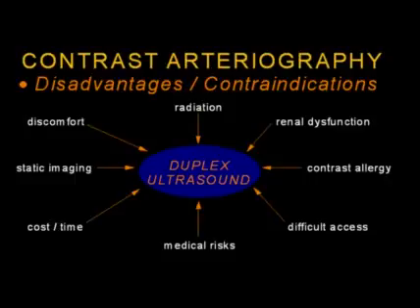However, there are various reasons why one might move away from the more invasive contrast arteriogram, and I've listed here a few of those issues, all of which point to duplex ultrasound as a viable alternative for imaging the lower extremity arteries.